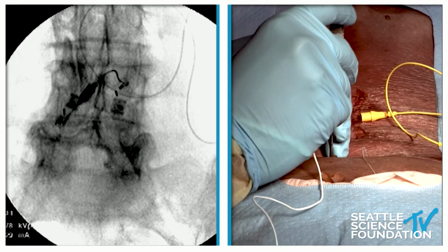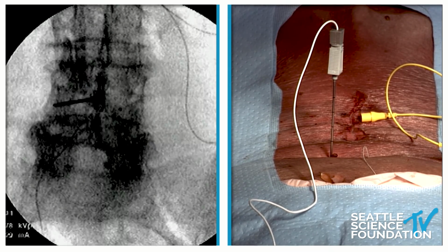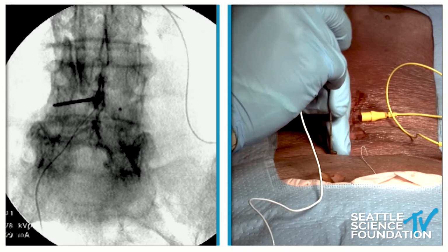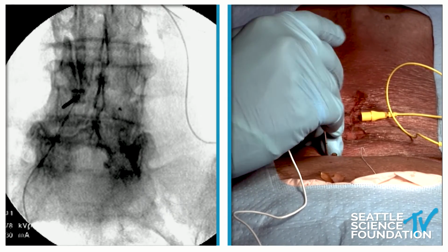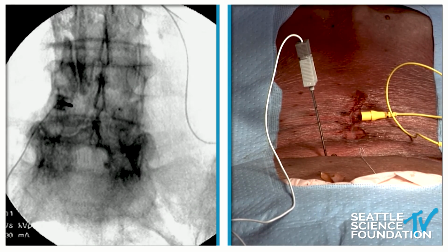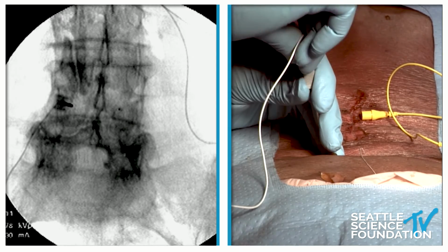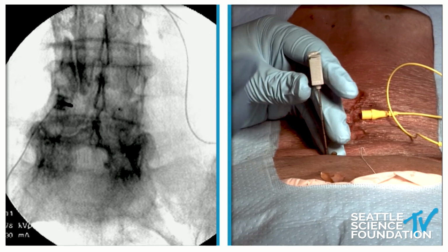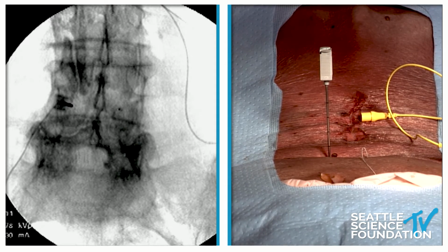And again, this is so straightforward. You know, even if that happens, it's really not a big deal. It takes an extra minute, but generally it's pretty rare for that to occur. And we'll just get it right back on that lamina. Perfect. I like that. Again, we would just make sure everything looks good, test, take this out. Hopefully that's all loaded up again. Perfect.